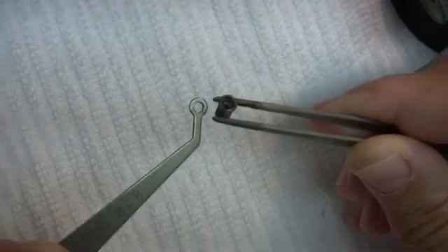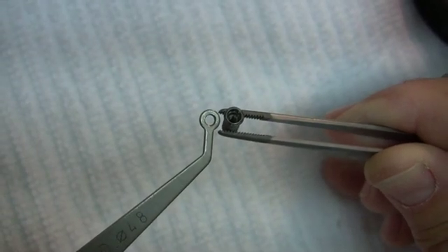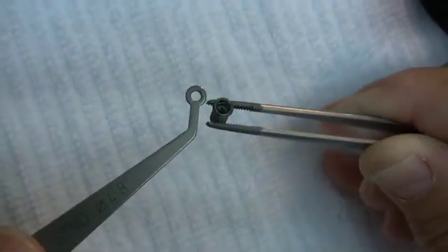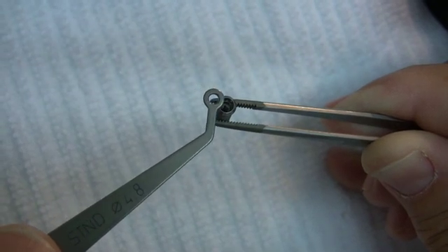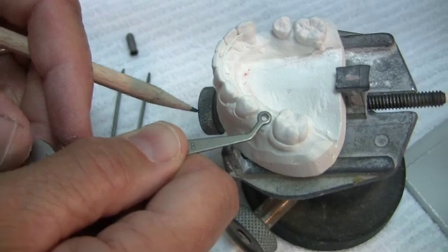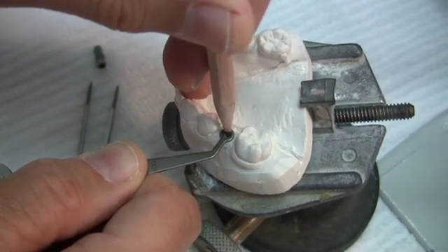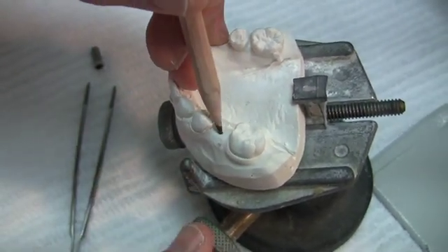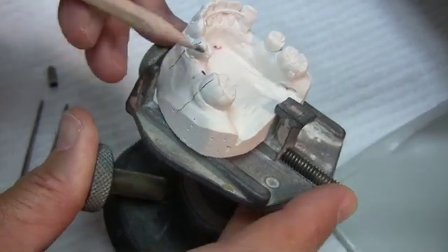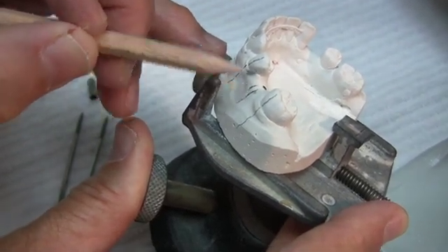I like to use an implant distance indicator by Straumann to mark the implant location on the model. The indicators are 3.5, 4.8 and 6.5 millimeters in diameter. As you can see here, the 4.8 is exactly the same as the implant platform. With this instrument, it is easy to position the platform of the planned implant with the proper spacing from adjacent teeth. Lines are drawn on the model to represent the roots of the teeth along with the axis of the planned implant.